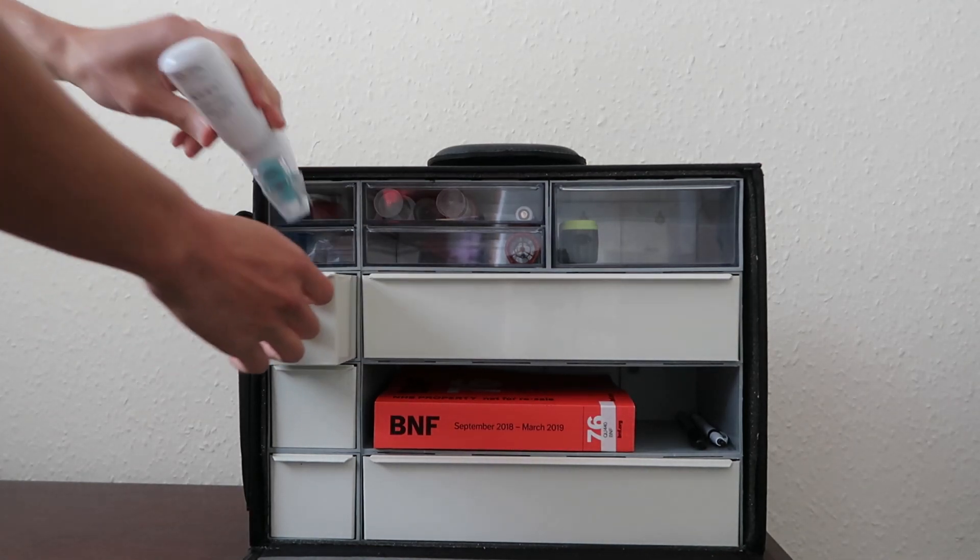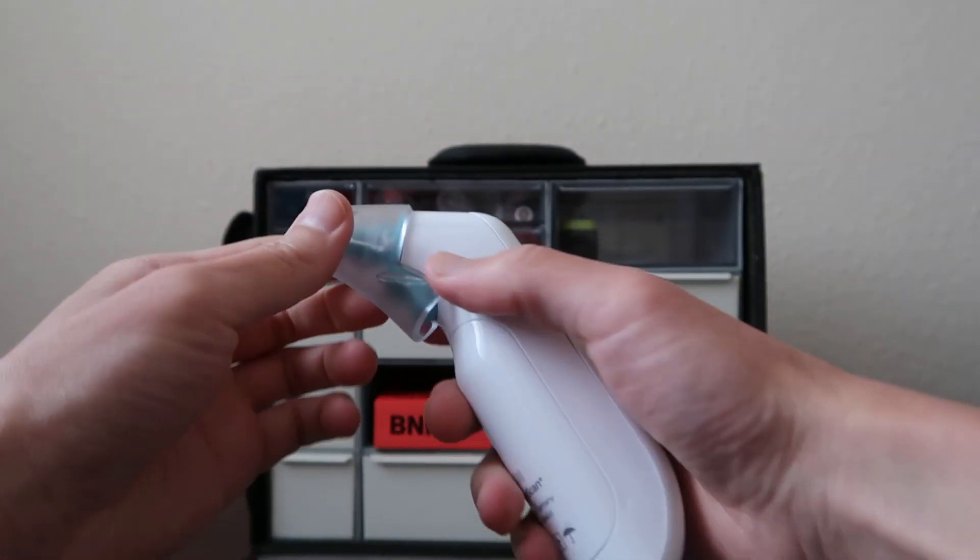A Braun thermometer to measure temperature — it's a tympanic thermometer.